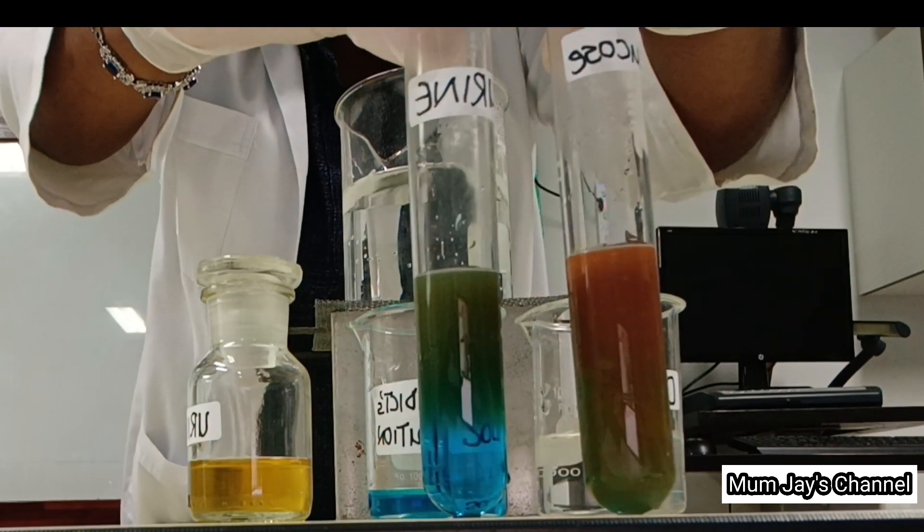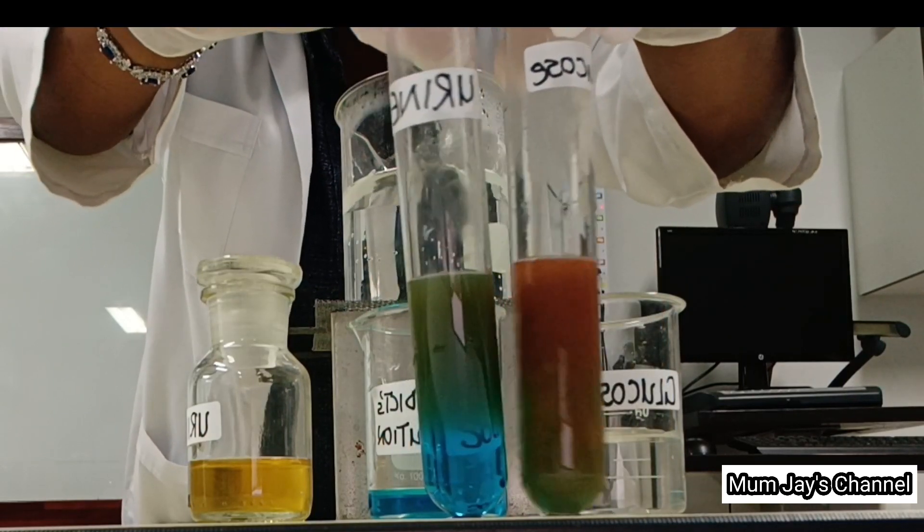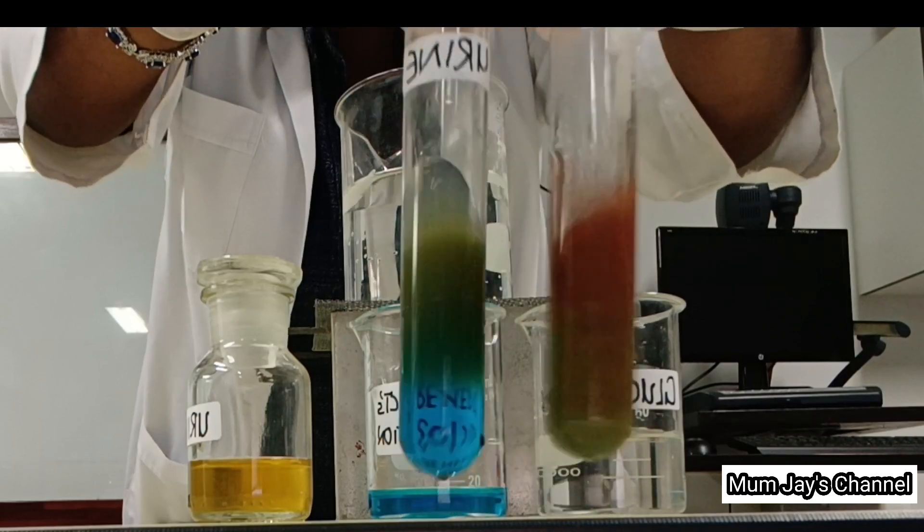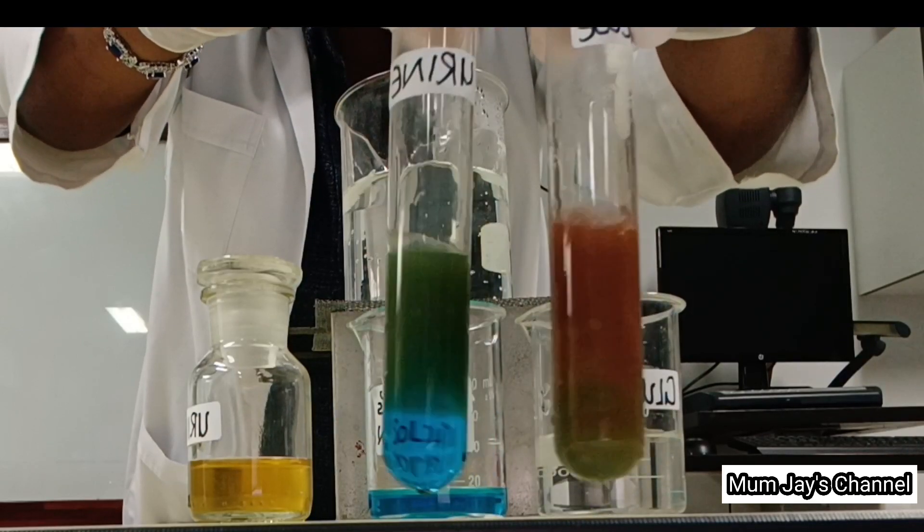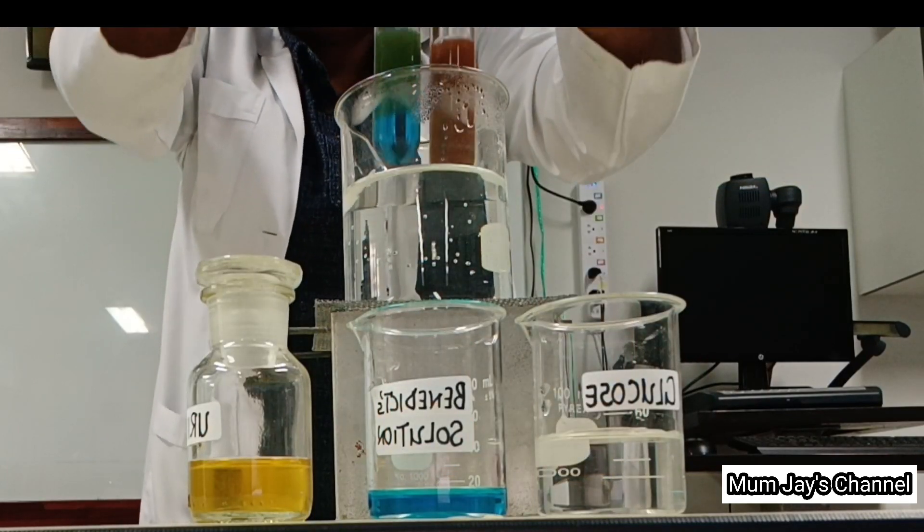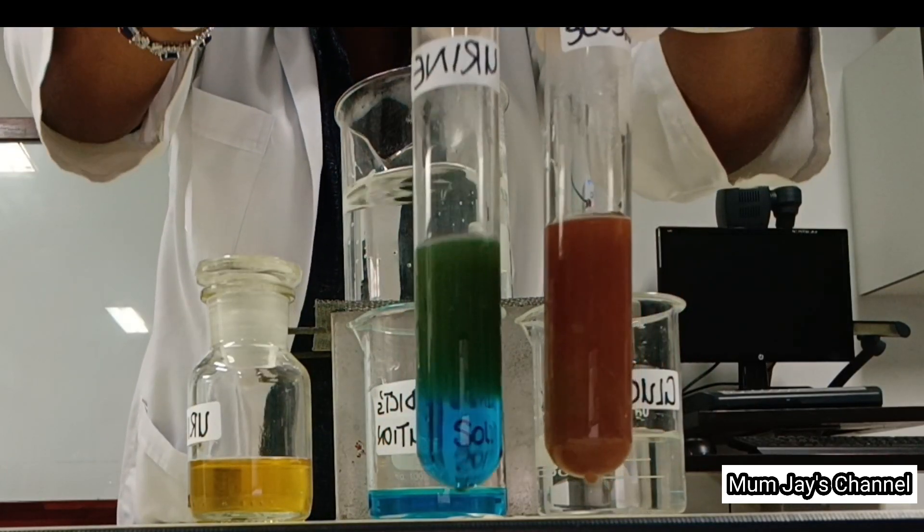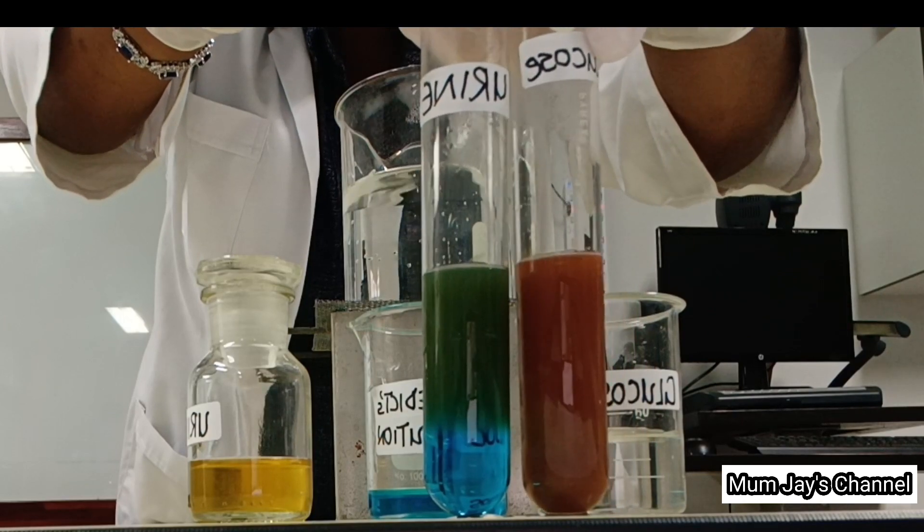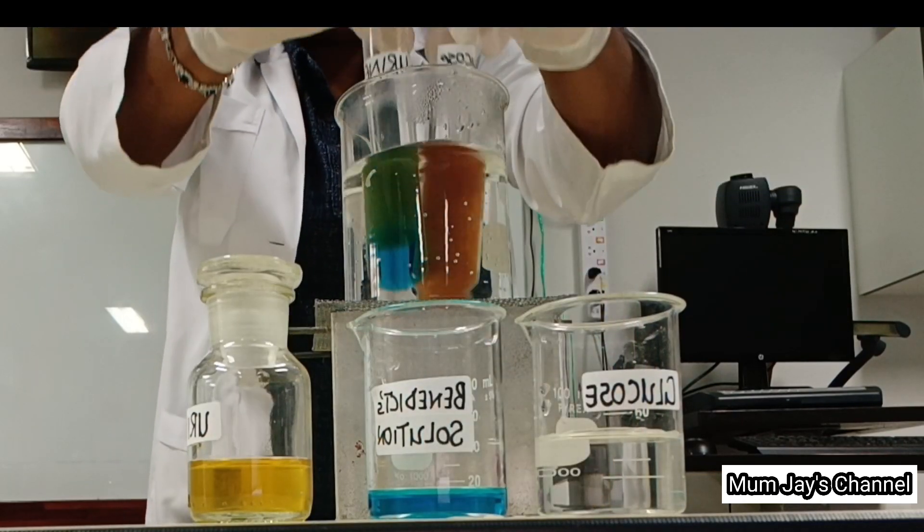You will notice a color change from the blue color of the Benedict's reagent to green and then to brick red. The brick red color indicates the presence of reducing sugars in the mixture.